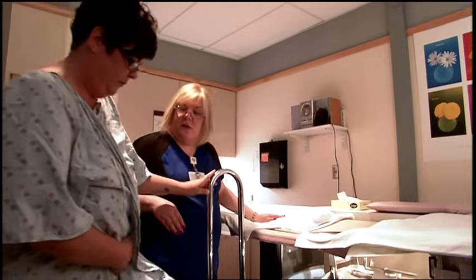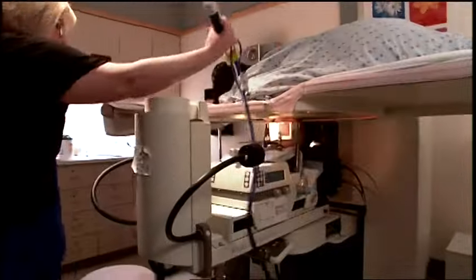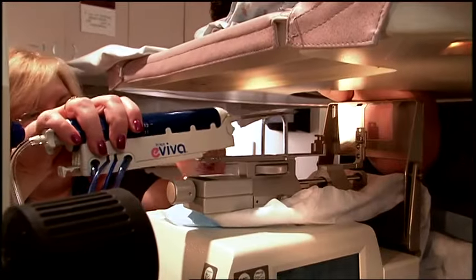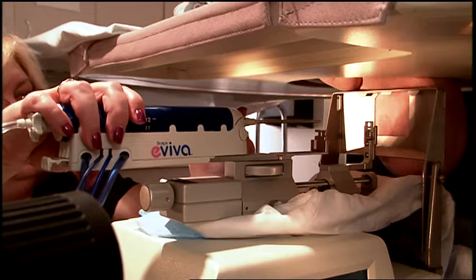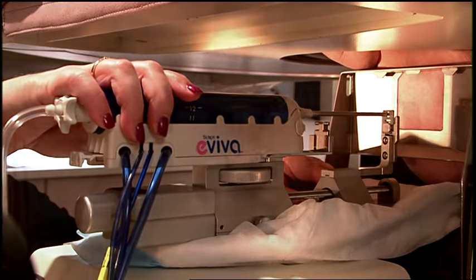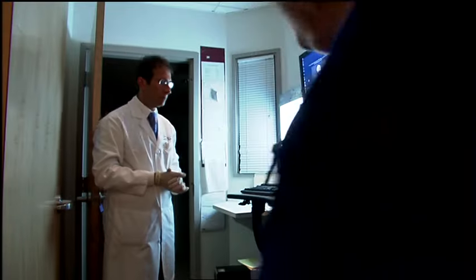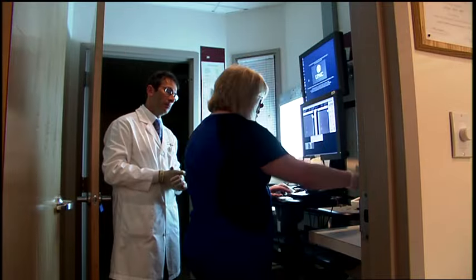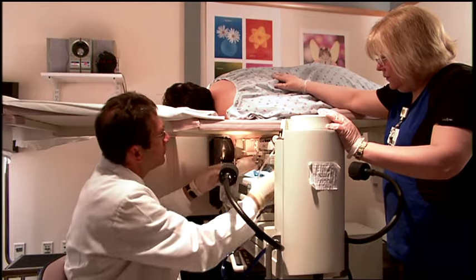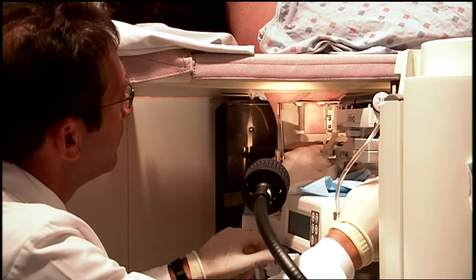The technologist positions the patient on a special table. Compression paddles are used to hold the breasts firmly in place and the biopsy equipment is moved into position. A series of images are taken to pinpoint the areas of interest, carefully positioning the imaging equipment and targeting the area of concern.